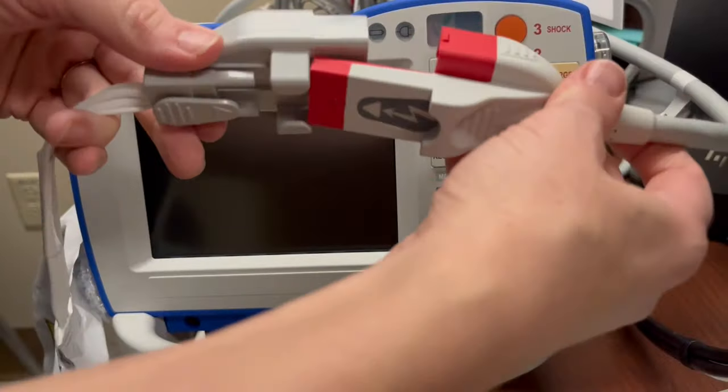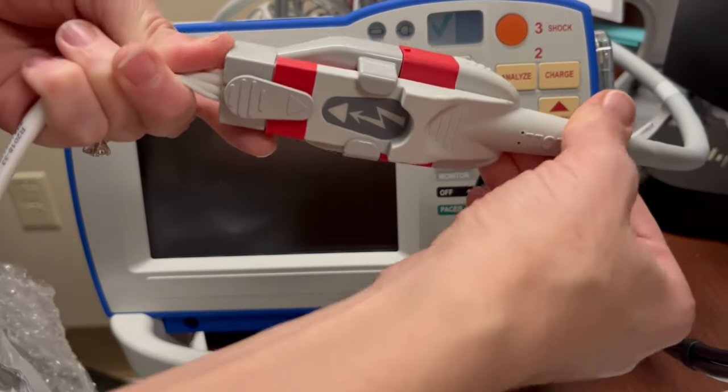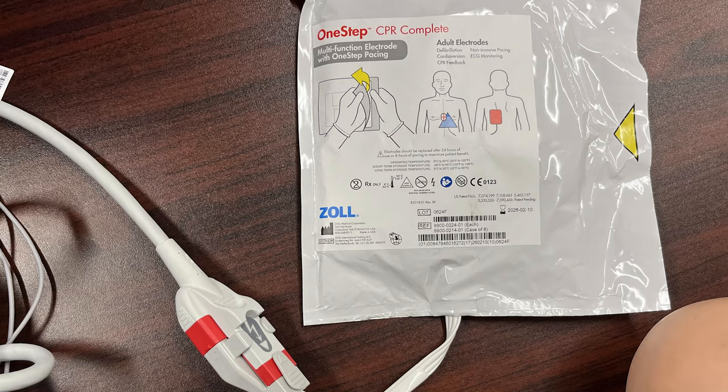This machine is designed for the pads to always be in place. Once you connect the pads they are locked into place. You can unlock them by pressing this button and pulling them apart. The pads must be sealed and not expired in order for them to work.